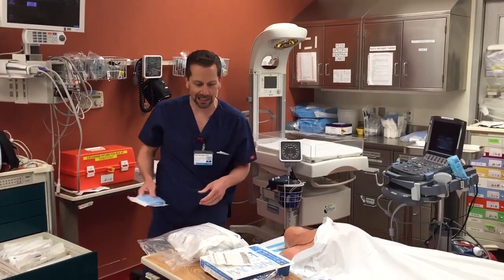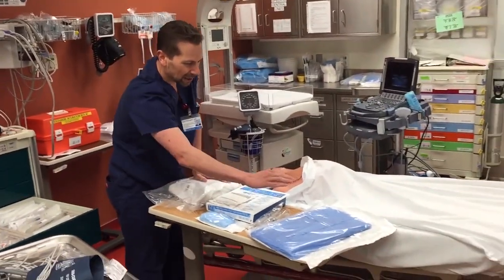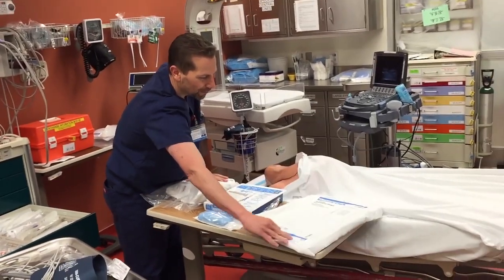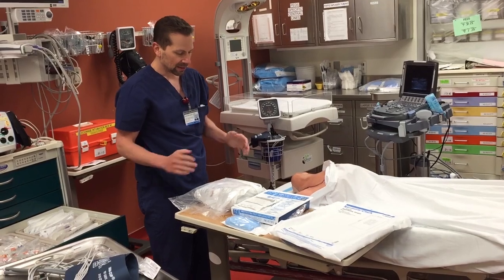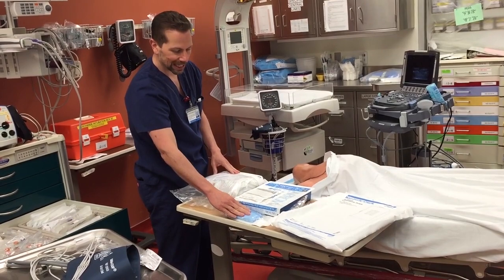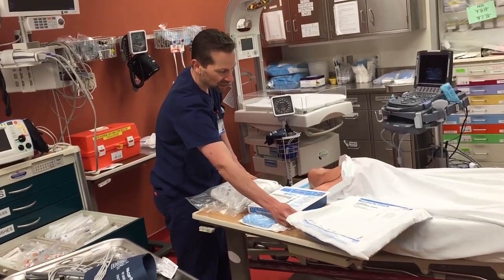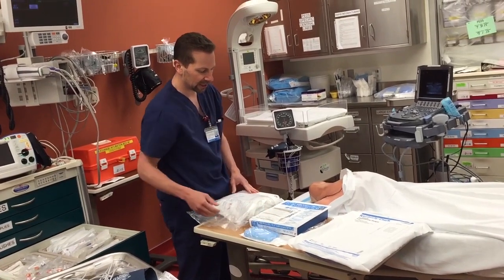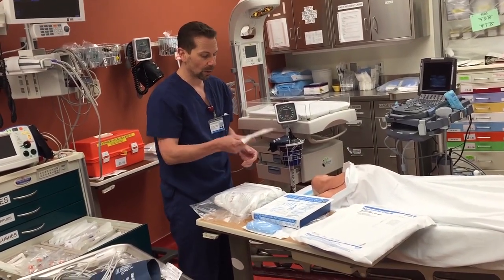Let's discuss the things you need to have available as you're getting prepared to do it. You need a huge drape — what we're working with now is pediatric laparotomy drapes; they're present in every room. You need your bundle, you need whatever central line you're placing, and if you're going to be using ultrasound, you need an ultrasound probe cover. It's nice to have flushes, though not essential — I have three flushes here. And whatever sterile gloves you are going to wear.